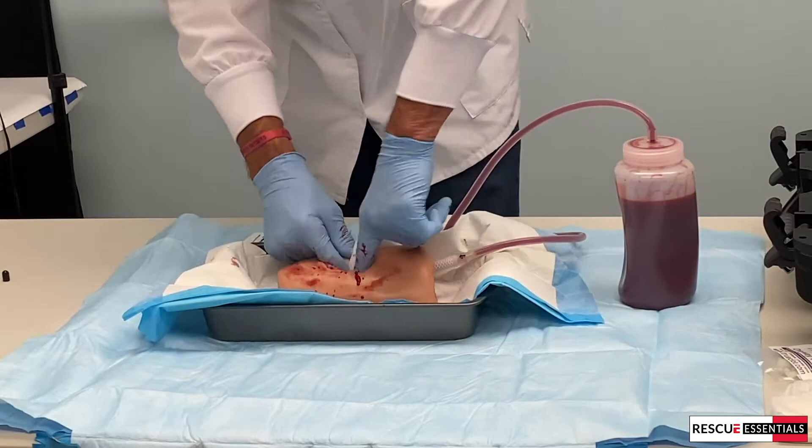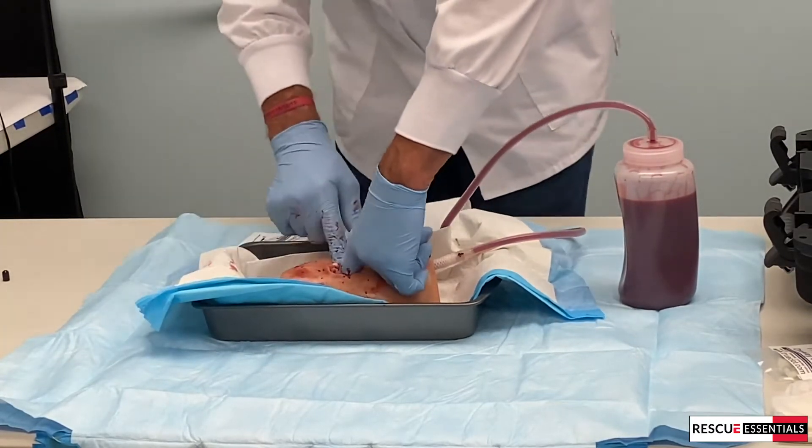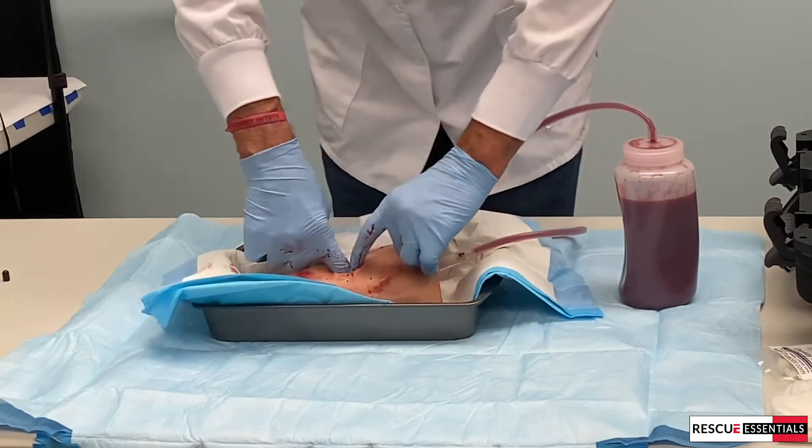Keeping pressure before I insert my next finger — finger over finger like that. I'm trying to make this go around the world.